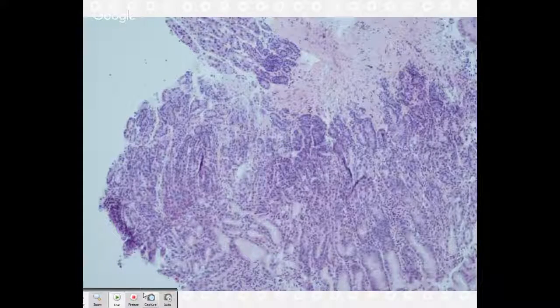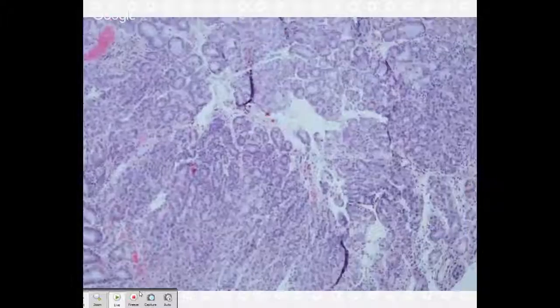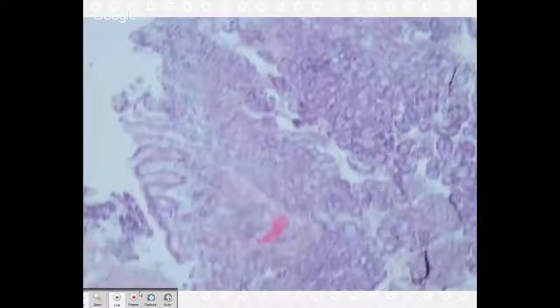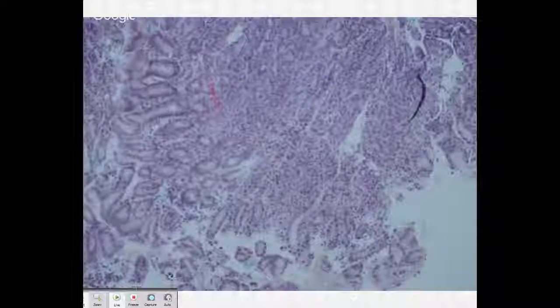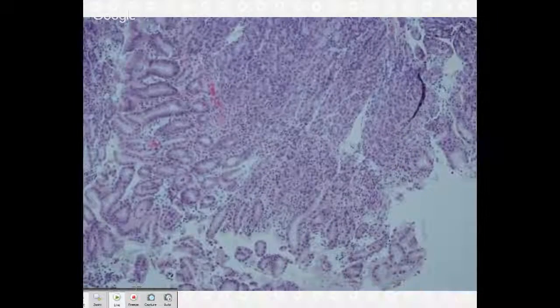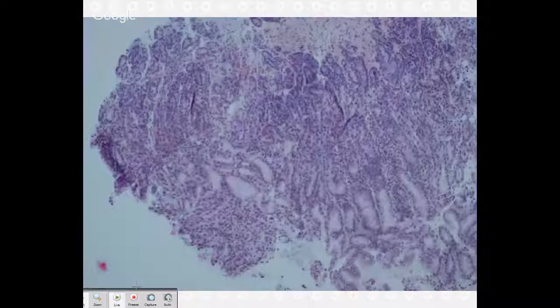All right, see the pits. You can see there's, I would say in between the glands, some active inflammation. Okay, so especially maybe this area. So it looks busy, right? Yeah. So in your normal stomach biopsies, your lamina propria should be really open. It should either be pink or kind of pale, edematous looking, because you're not expecting that many inflammatory cells to be in there. So it looks really busy, partially because our lamina propria has stuff in it.